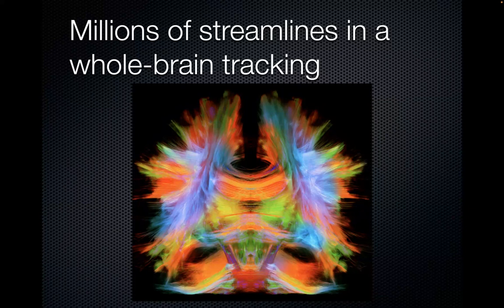You're going to get through crossings. You might get a bit lost. We're going to talk about that in the second talk, but you're going to reach gray matter and you can start actually creating a connectivity matrix here, right? You can actually start wondering, how are these 2 points connected? How are these 2 points connected?